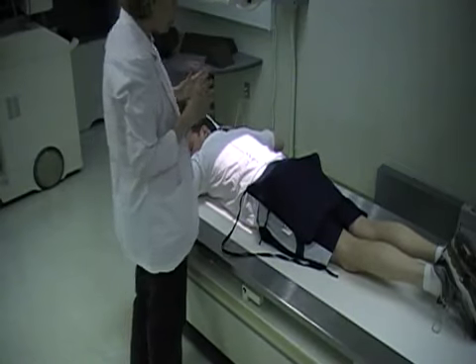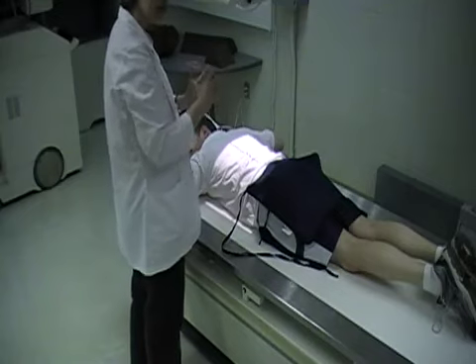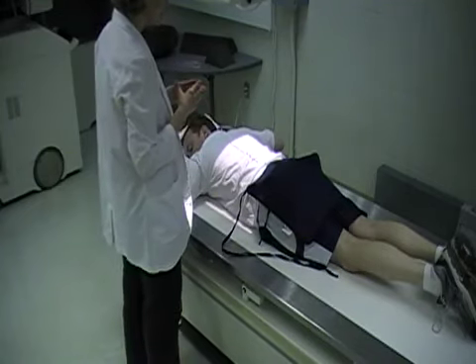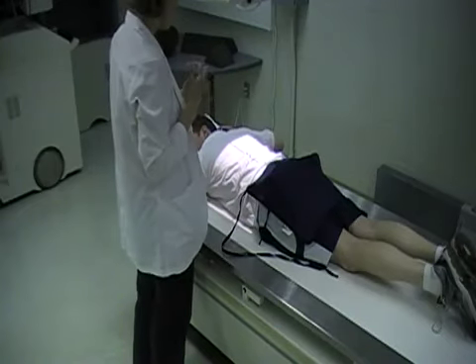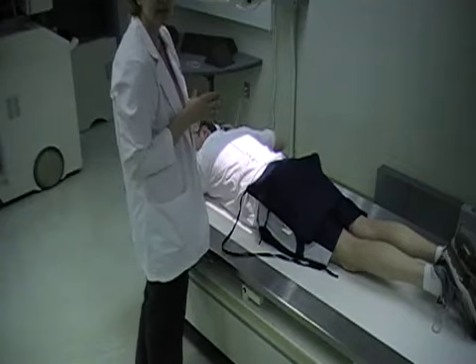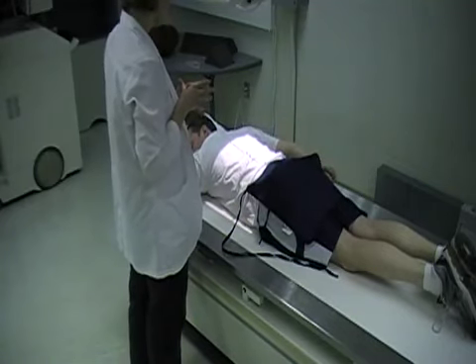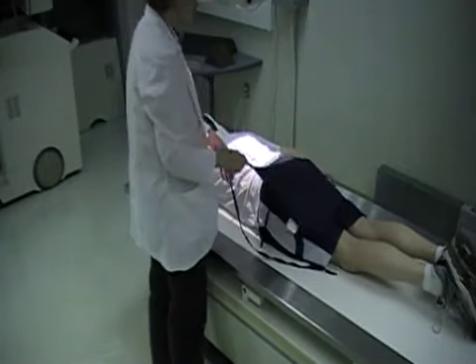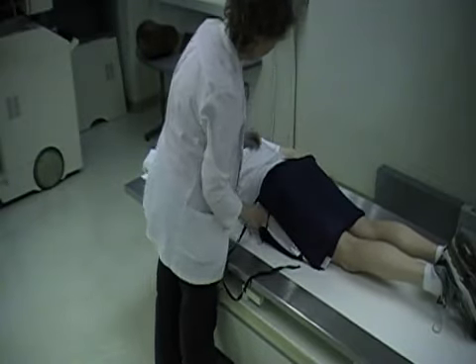Once again, if you're using the smaller image receptor, the 11 by 14, go ahead and turn your film crosswise, and that gets the stomach as it stretches across, because on the AP and the PA, the stomach does go across. His shielding is slipping, so I'm just going to reset that.